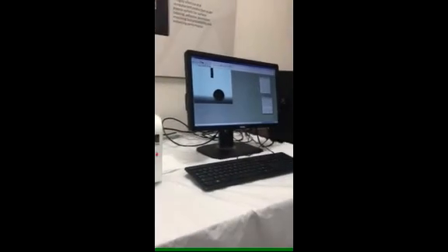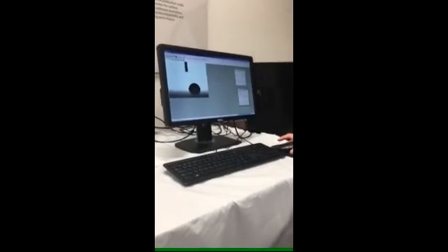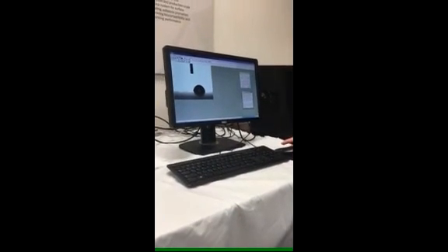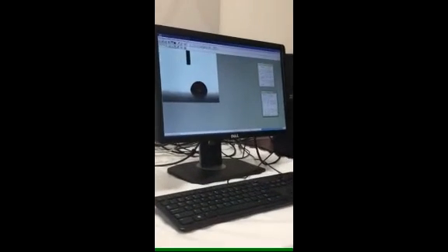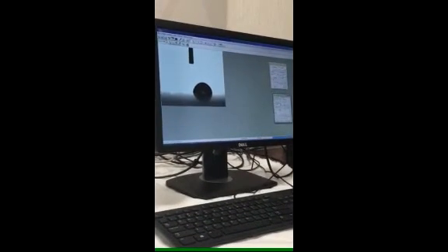With this feature, it's possible to capture up to 60 frames per second, making it possible to see the advancing and receding contact angles.